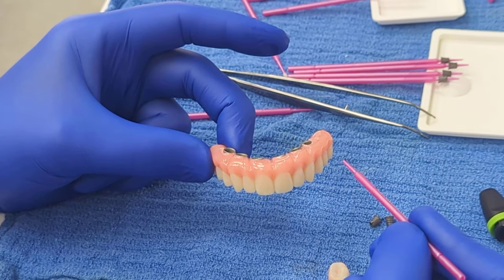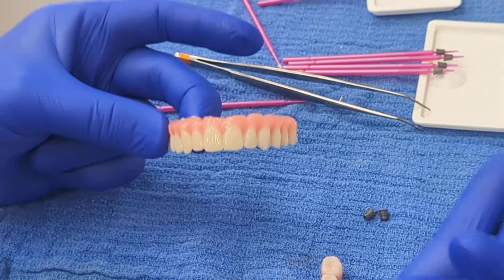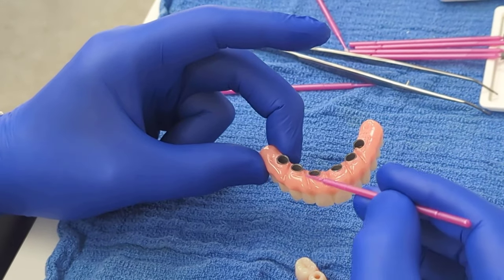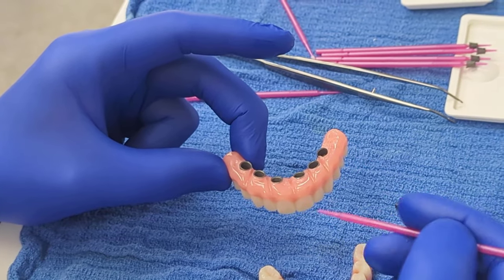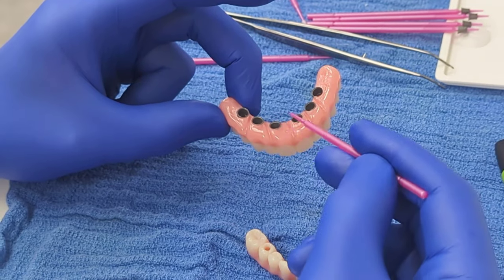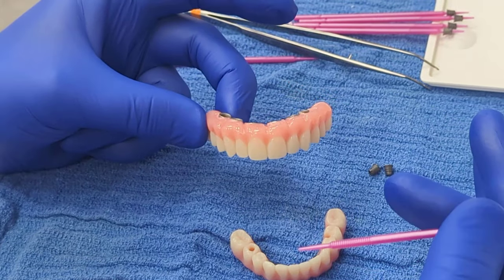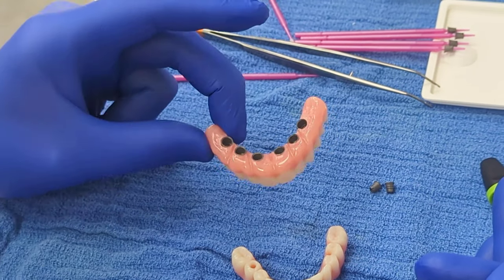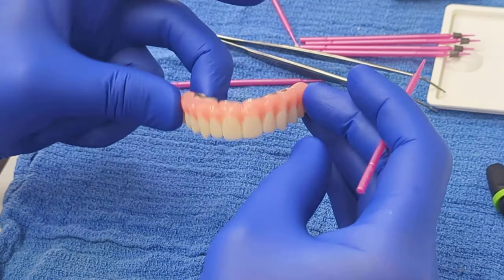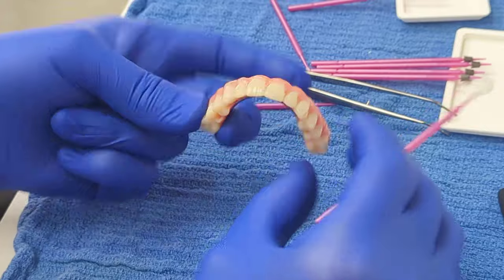Flip side of that is that if you actually have a case where the soft tissue has changed and you have too much space under there, what's beautiful about these materials, and again, it's a balancing act of materials, is I can add to this. I can actually take this out. I can sandblast and clean the surface, and I can get what is the equivalent of a composite mask material, sandblast it, use the adhesive, and add a little bit of contact so that if she's got air escaping somewhere, I can add to it. Can't do that with zirconia, and that is also a big negative of zirconia and a big positive of our generation 4 materials.